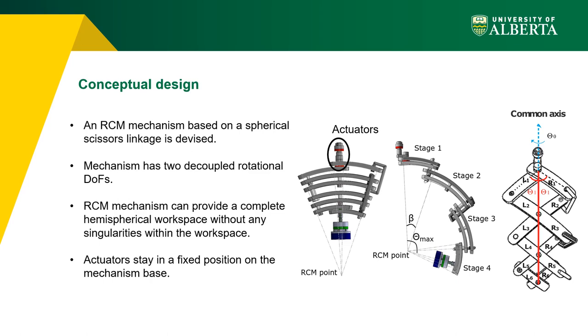The left figure shows the starting configuration and the middle figure shows the final configuration of the device. In order to eliminate the dead length of the conventional scissor linkage, the mechanism is designed to consist of various stages arranged in a cascade manner. Actuators stay in a fixed position on the mechanism base.